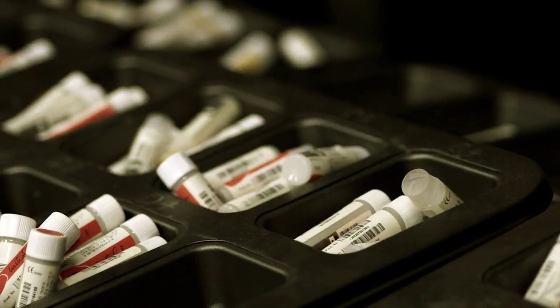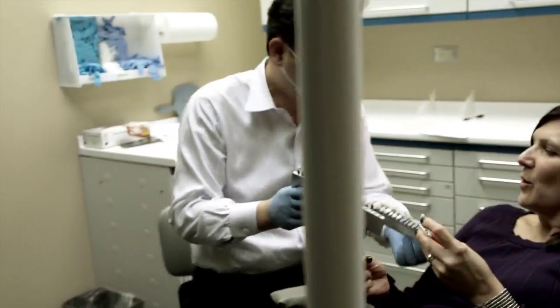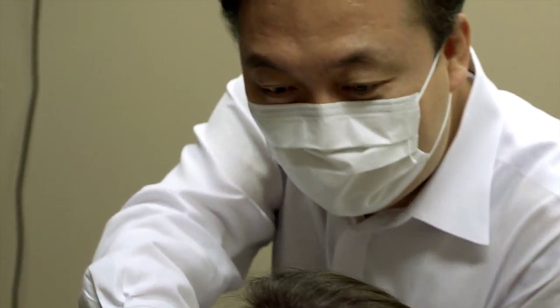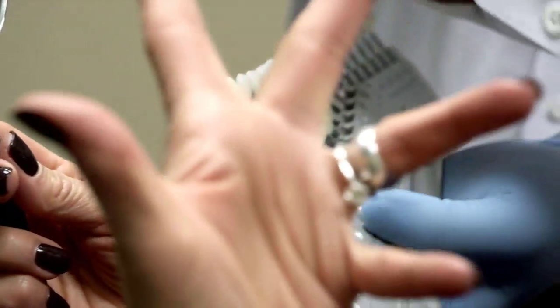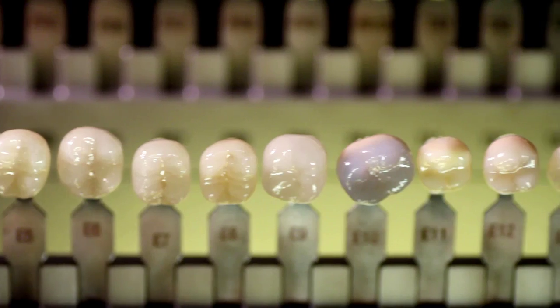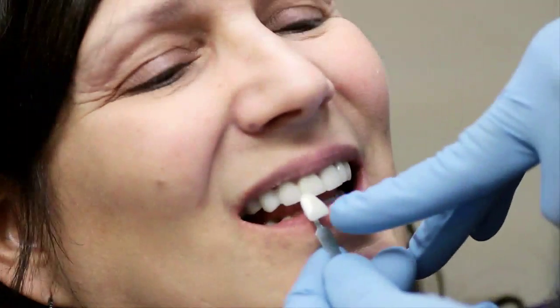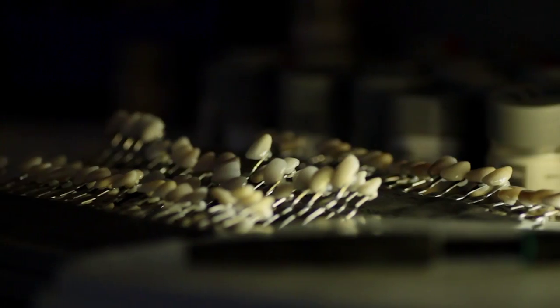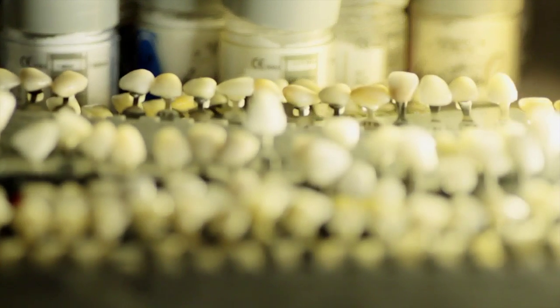Seasons of Life gives you a broad spectrum in the form of a shade system that is modeled to a patient's age group. A decade ago, Kahng, CDT, first began researching the difficulties of shade matching. A technician for over 20 years, he recognized the challenges in the industry. As a result, the concept of the Chairside Shade Guide came into production in 2009. Since its introduction, it has been revised, updated, and upgraded to the version you see today, Seasons of Life Ceramic Shade Tabs.